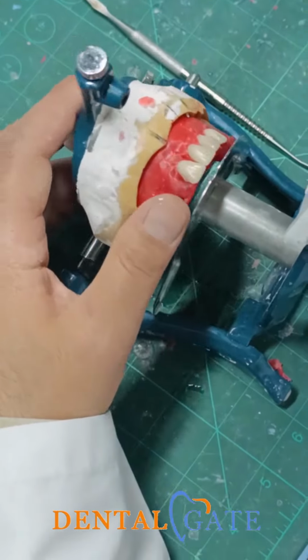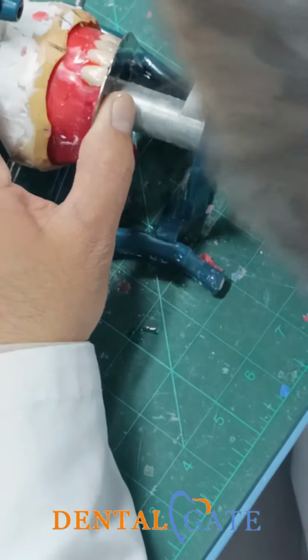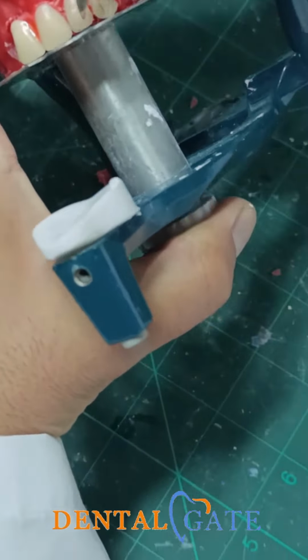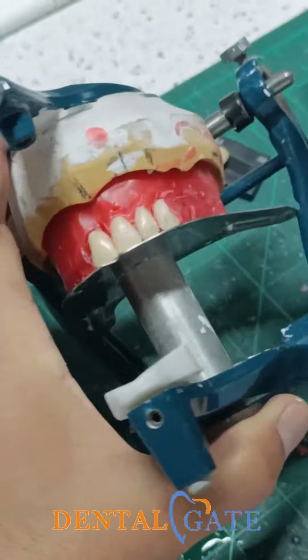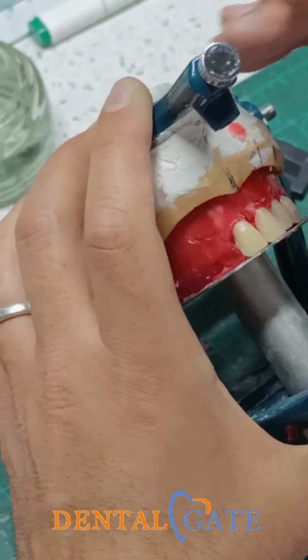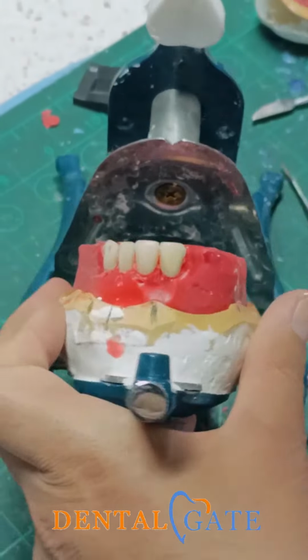Okay, so now make a final sealing, and be sure there is a contact here on the central incisor. So be sure the curve follows the first one, because I start to put my lateral on the other side. So we should simulate the same curvature on this side. Okay. So I think the central incisor is in a good, normal position. There is no conflict here. I will start with the lateral now.